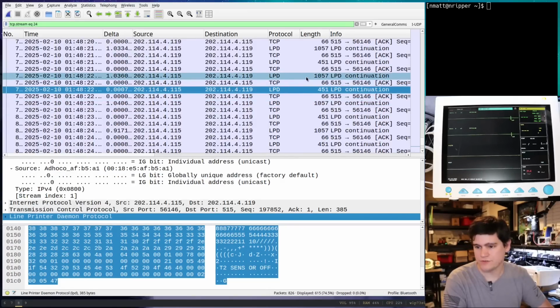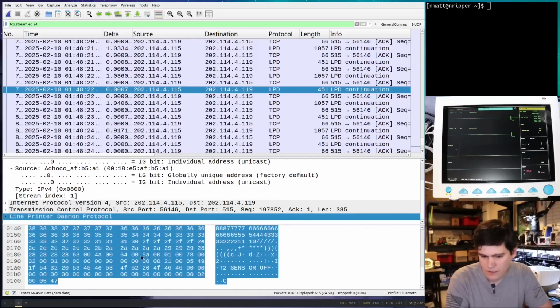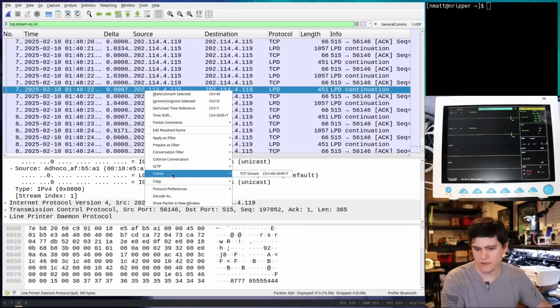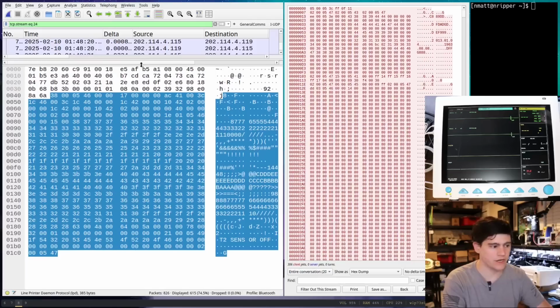All right. Gonna make sure I'm dealing with a good packet here. I am. All right. Yeah, so this is gonna be a great packet for us to look at. All right, sweet. So let's go right here. Go follow TCP stream again. And actually, let's just zoom in on this right here.